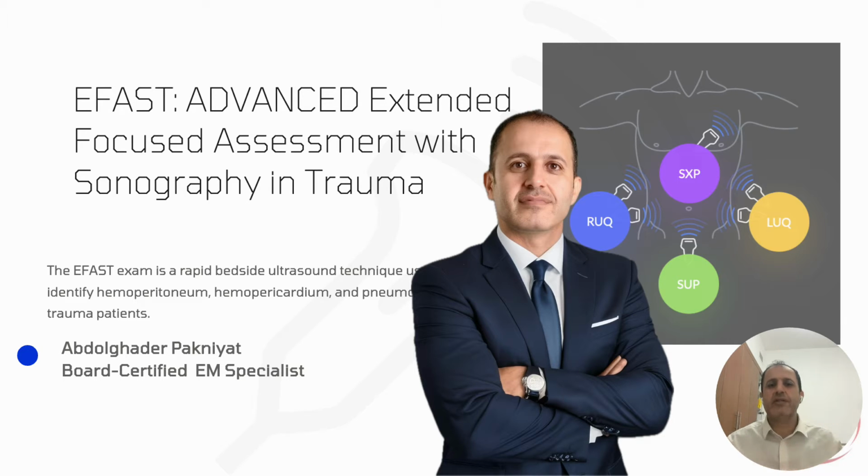But this course is just a short review of basic ultrasound, or knobology, and also of the EFAST. It doesn't mean that everyone who watches this video will get enough skill to properly do the ultrasound examination. It's just a short review on this subject.